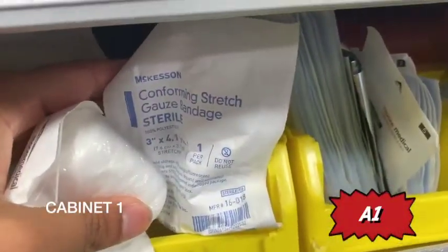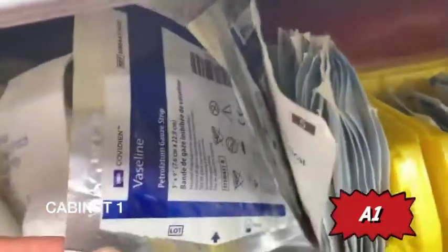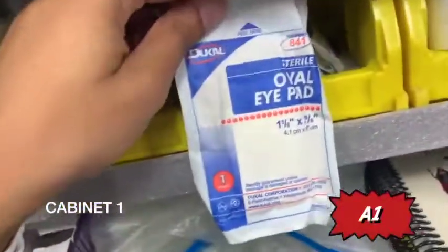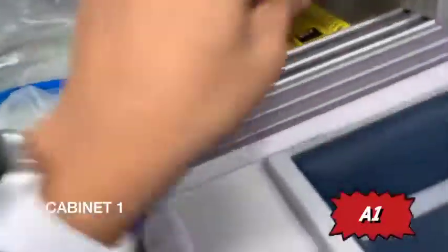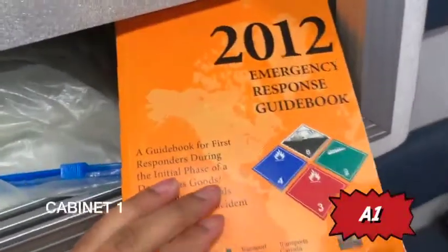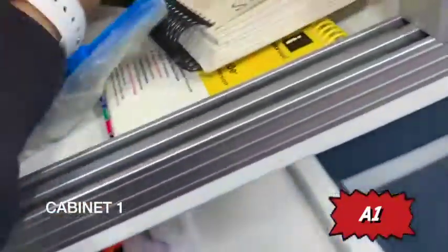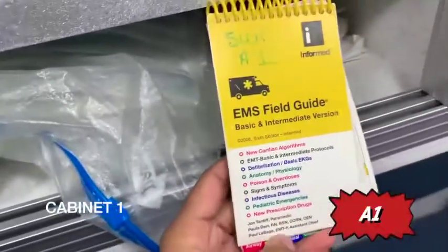You have gauze pads — the shiny packaging always indicates Vaseline gauze. You have your eye pad, medical tape. Moving downwards: a chem and bio handbook, your hazmat book — this will tell you about chemicals that are potentially dangerous in EMS situations — and an EMS field guide.